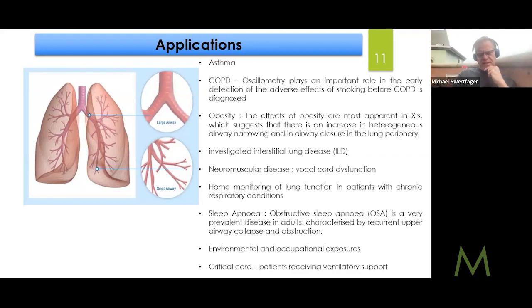Yeah, so the later ResMed devices actually do this as well, but they do it with air pressure. They do micro air pressure pulsations. Yes, I think it's square, on, off, etc. They identify whether your sleep apnea is obstructive or central. If you stop breathing about 4 or 5 seconds into usage, you'll actually feel these puffs. I actually stopped using the ResMed devices because of that, and I went to a different device because it wakes up people who have central sleep apnea, or prevents them from going back to sleep. Some technology like this, if it's using sound waves going down the tube, could be very beneficial to Philips, ResMed, Fisher Paykel.